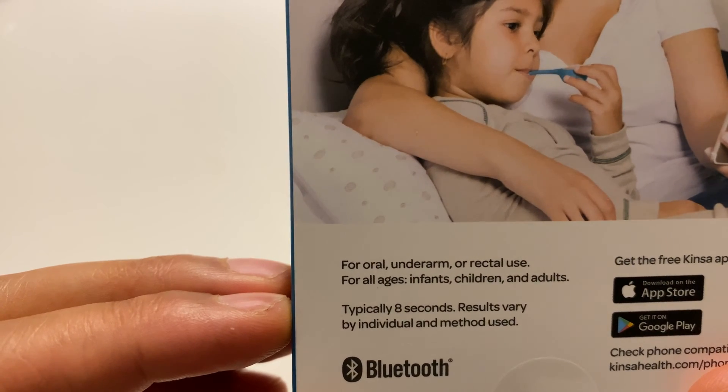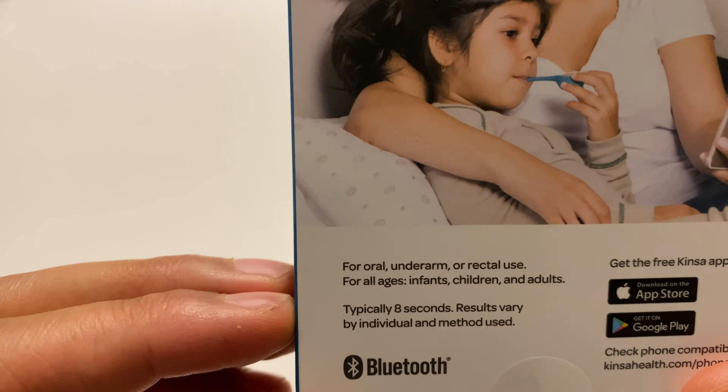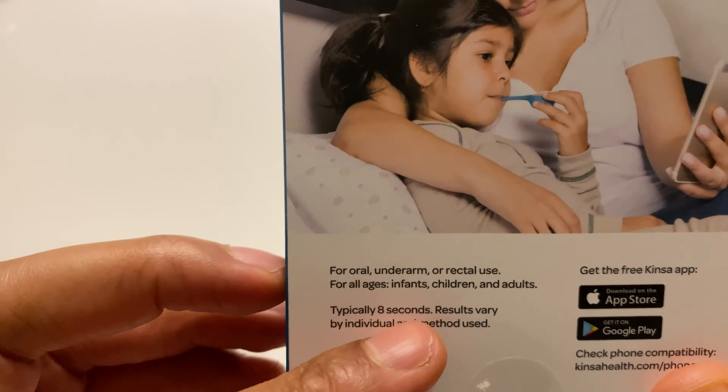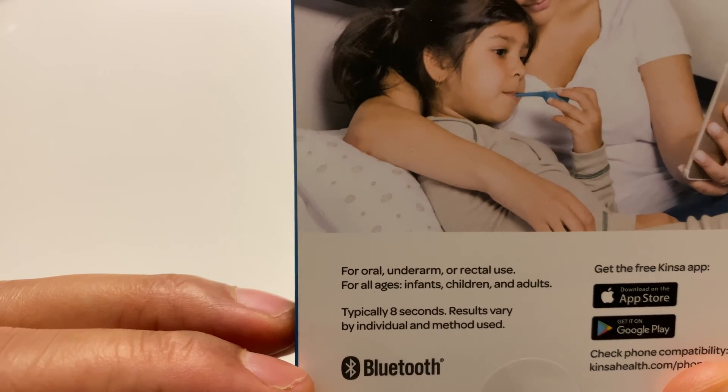You can use it oral, underarm, or rectal. It's for all ages — infants, children, and adults. Typically eight seconds, that's what it said on the front. It says results vary by individual and method used.